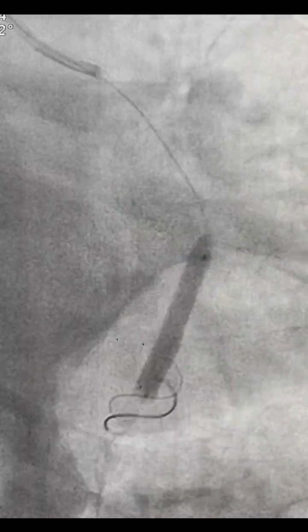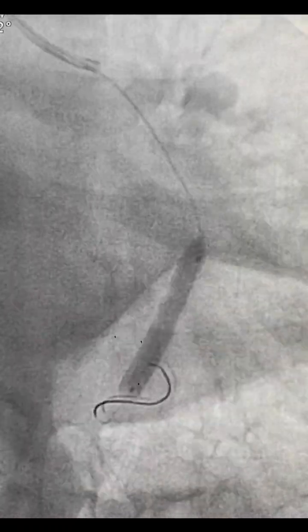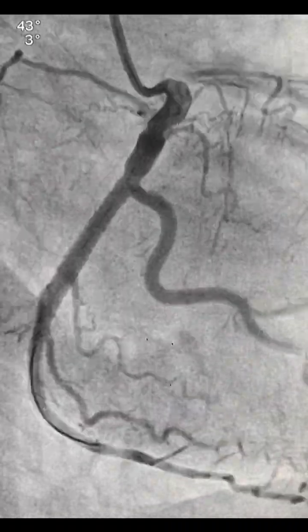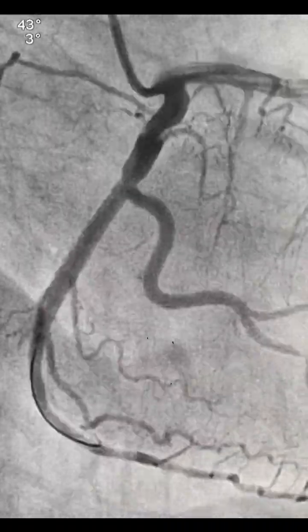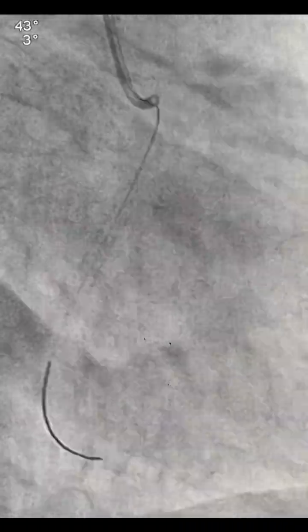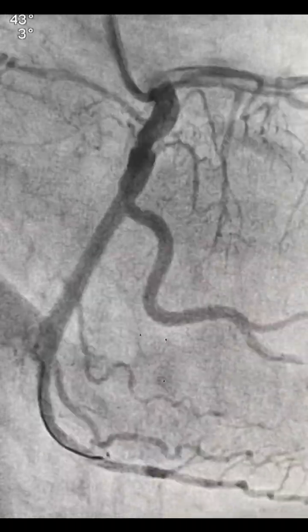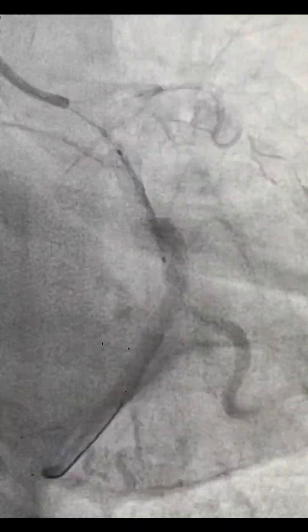Deployed at around 22 atmospheres, which was the RBP, you can see some under expansion of the stent. So we did the NC for that later, after the proximal stent.